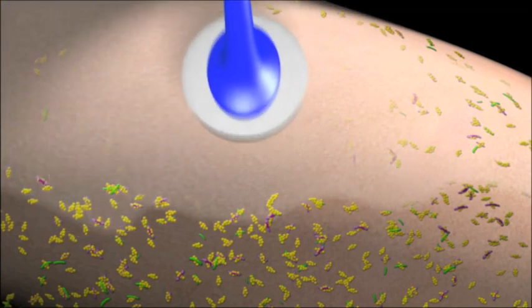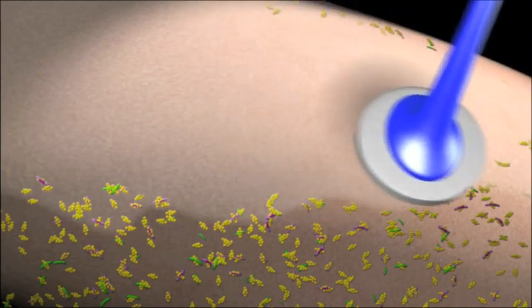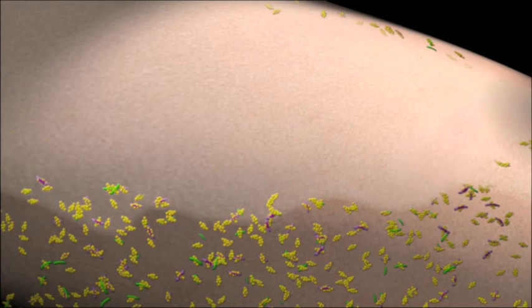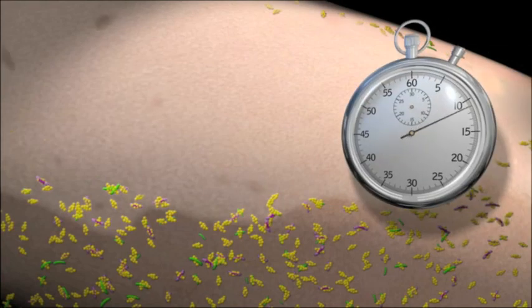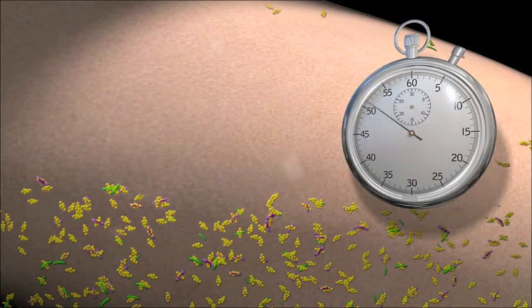Prep the skin using a vigorous back-and-forth scrubbing motion, then work outward to the peripheral area. It is important to allow the area to completely dry for a minimum of 30 to 60 seconds. Maximum sterile barrier precautions prevent cross-contamination of transient organisms and protect the skin preparation.